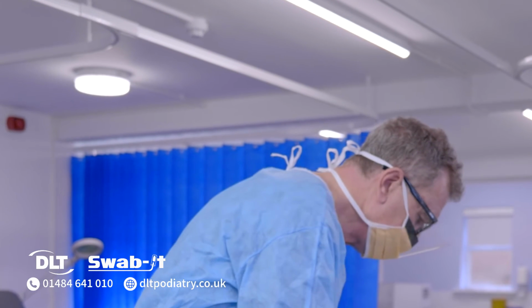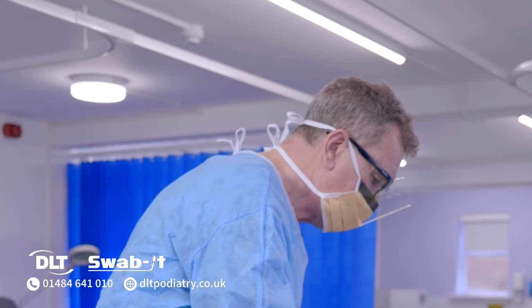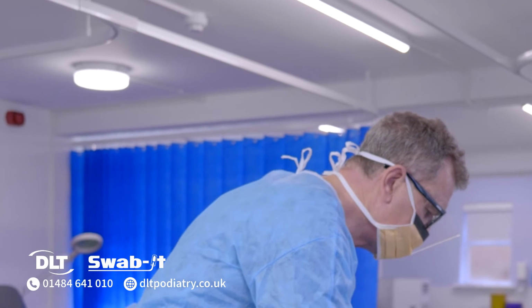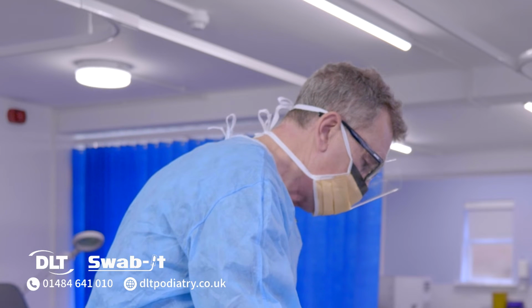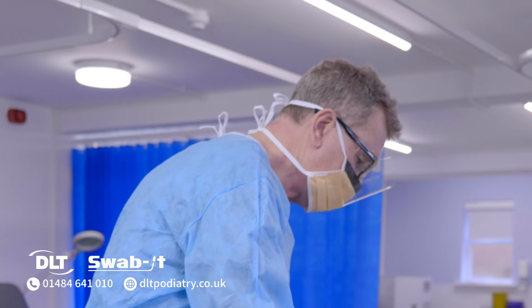So the first dressing has to be obviously quite large and thick, because when the patient goes into dependency, there is a small risk that you might get some minor bleeding. Also, when the patient leaves, there's always a risk that it could be knocked.